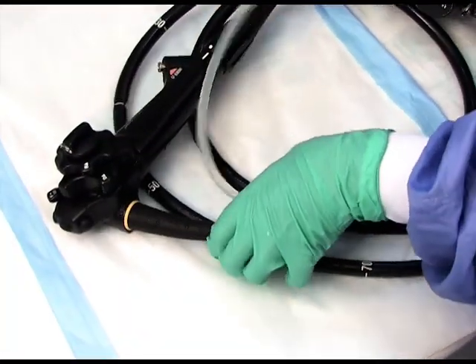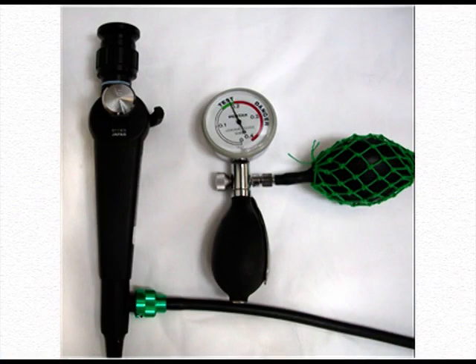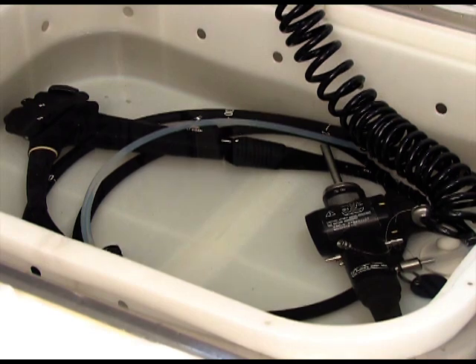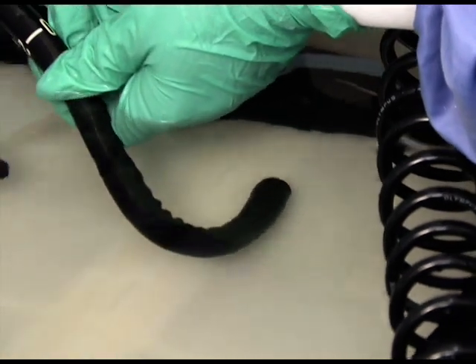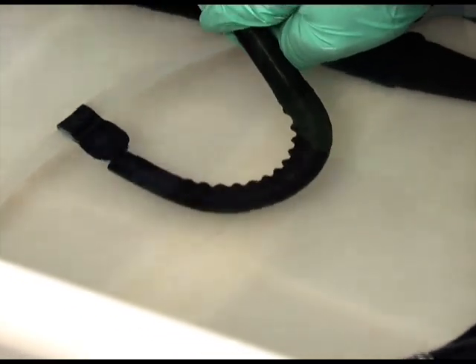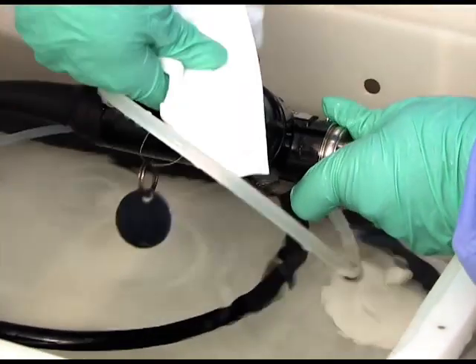Fully immerse the endoscope in fresh, clear water and observe for a continuous stream of bubbles. If the leak tester has a pressure gauge, as with Pentax endoscopes, observe for pressure loss prior to immersion, as this indicates a significant leak — in which case the endoscope must not be immersed. Observe the head, insertion tube, and umbilical cable for any bubbles. Flex the distal bending section in all directions using the control wheels, as flexing may help detect a damaged section that would otherwise go unnoticed. The processor head must be removed from the water before disconnecting the leak tester.